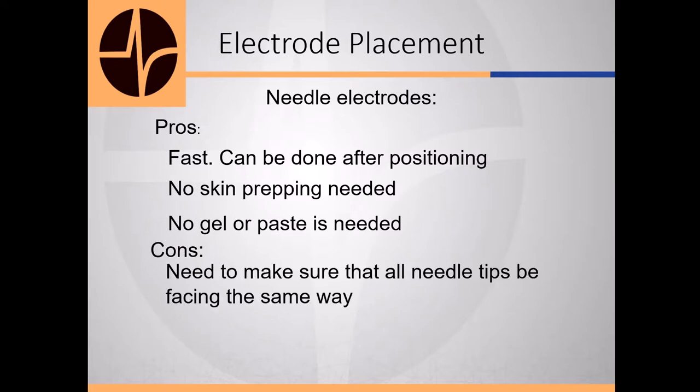The downside is you need to make sure that all the needle tips are facing the same way. So they all have to be placed towards the front of the patient's head or towards the back of the patient's head. One or the other, not towards the center, back or forth.